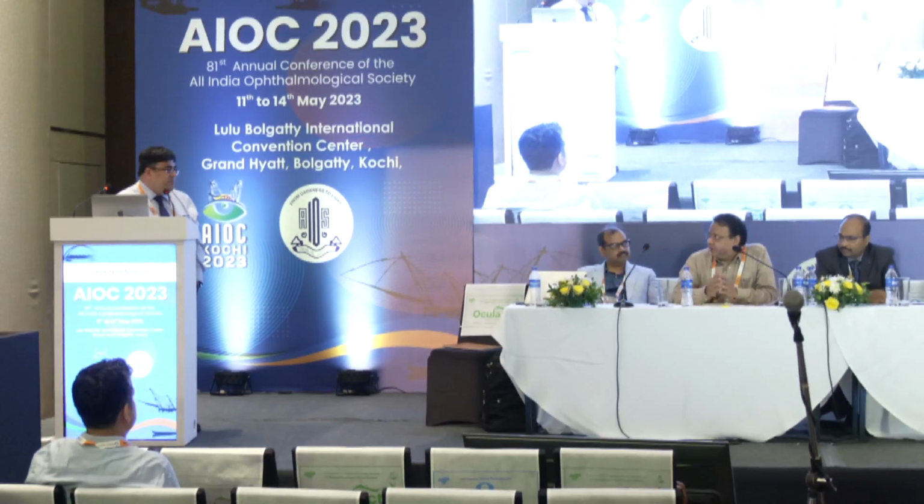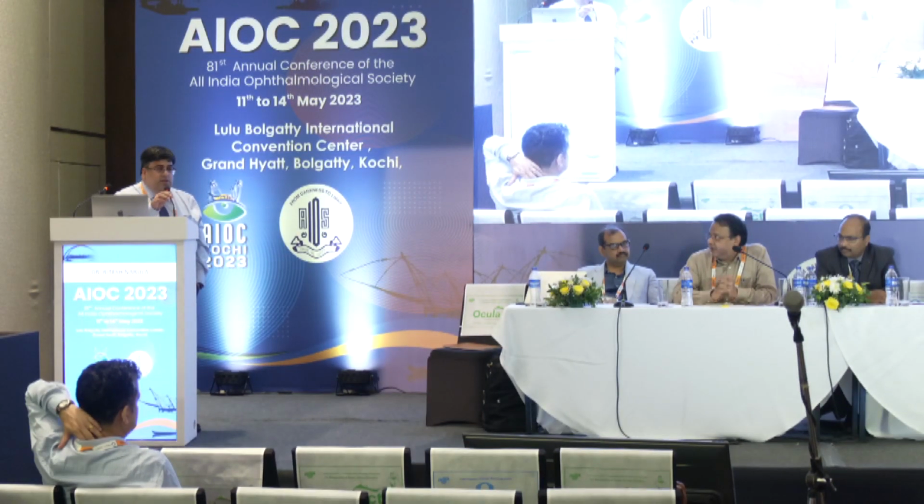Which machine are you using at your center? Sorry, which machine are you using in your center? And like, you are using multiple platforms. Yes. So which platform do you see the best in diagnosing?